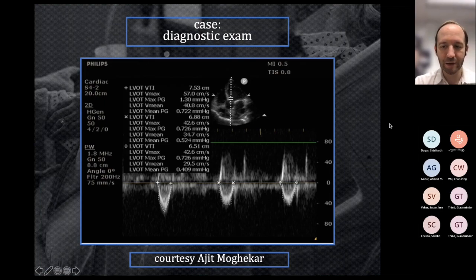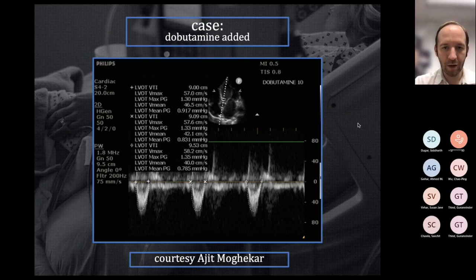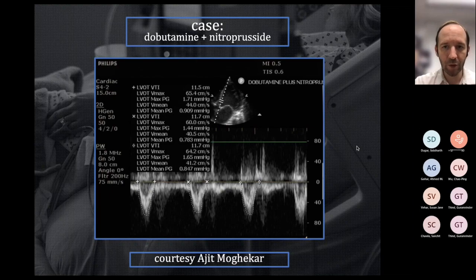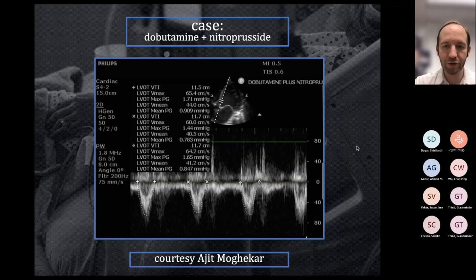With the addition of dobutamine, the LVOT VTI went up from 6 to 9 — that's a 50% increase, already an improvement in cardiac output. Then with dobutamine plus nitroprusside for afterload reduction, the LVOT VTI went up to almost 12 — nearly doubling across the course of treatment. So not only was this a helpful diagnostic tool, but it was a helpful treatment tool as well.